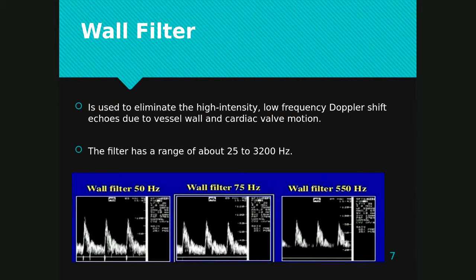When they say low frequency, you can actually define this as low frequency or velocity because they both show up on the scale on the y-axis. It depends on what we set it up for. So this y-axis right here is going to be either velocity or frequency.